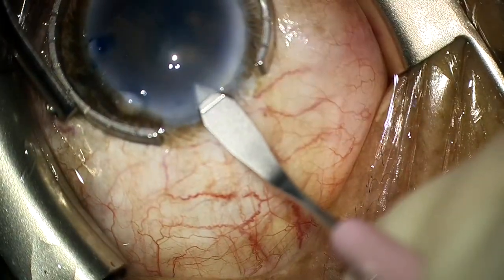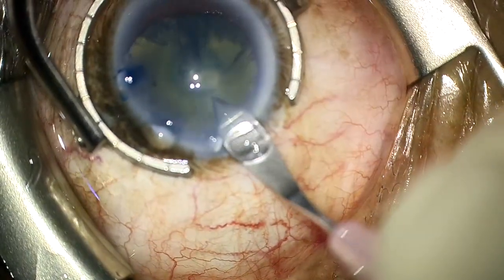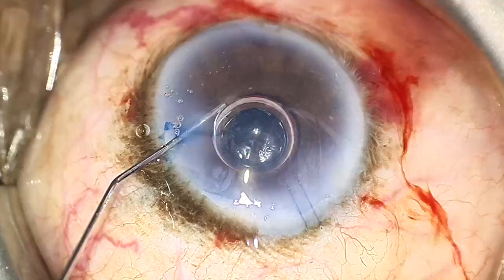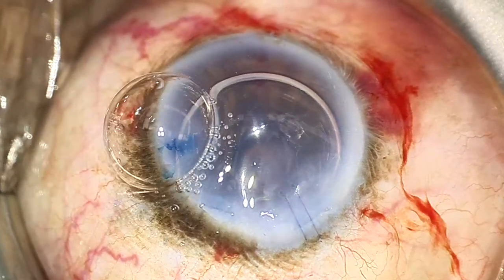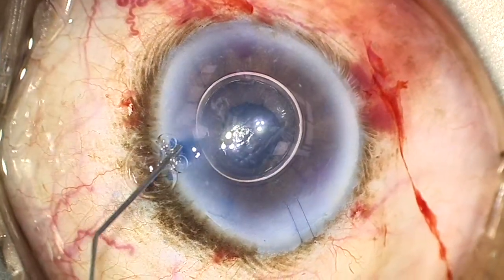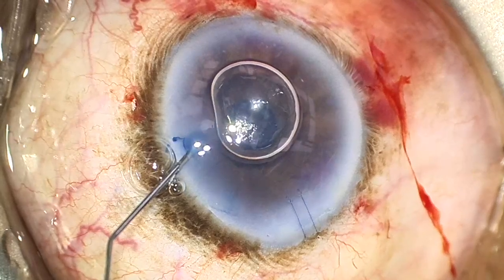After much deliberation, we decided to proceed with the phaco, and the main wound was made in the area of the Descemet's detachment, which had now been reattached. After an uneventful phaco, an air bubble was injected into the AC and left in place for five minutes. After five minutes, the air bubble was made smaller so the patient would not go into pupillary block on the night of surgery.